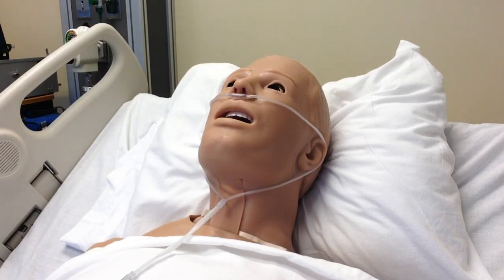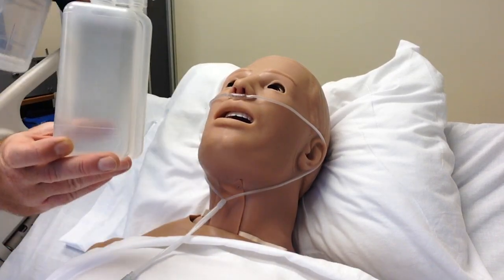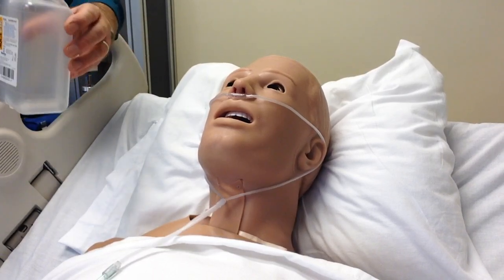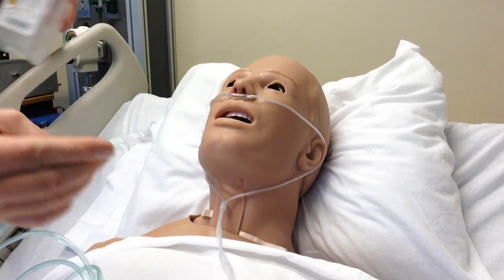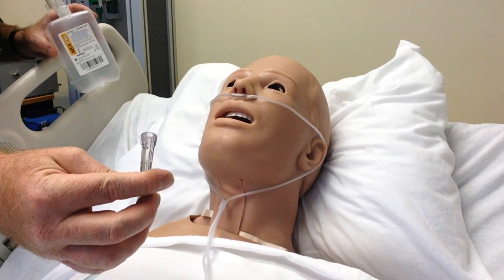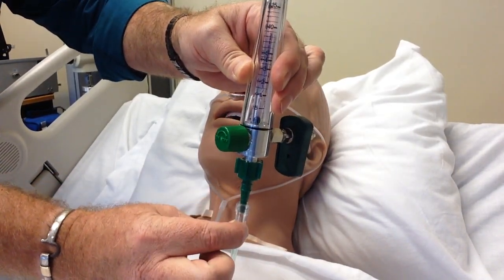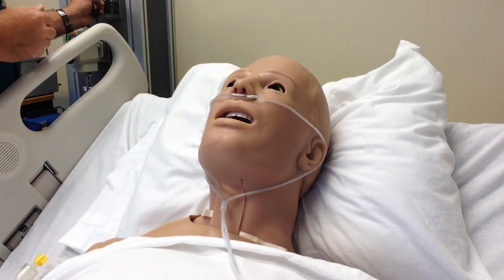If you are running at 4 liters per minute or higher, you need to use a bubble-through humidifier. Water would be in here. The oxygen comes down and just bubbles through, and you connect this end to the bubble-through humidifier. If you're not using humidification, this end will connect directly to the oxygen flow meter to the Christmas tree. Something like this. I will cover the humidification more when we go over humidity after midterm.